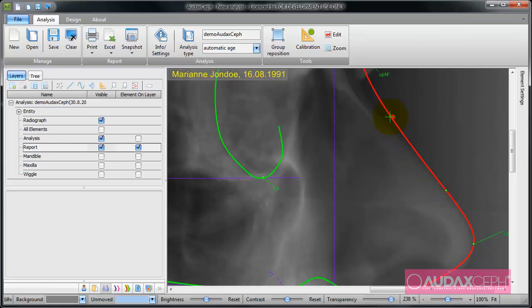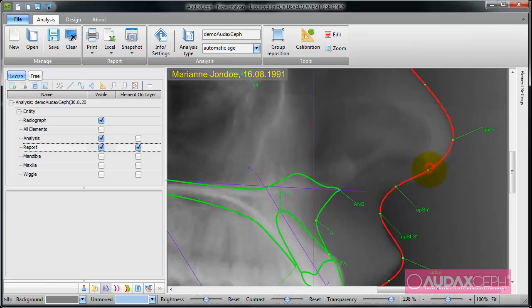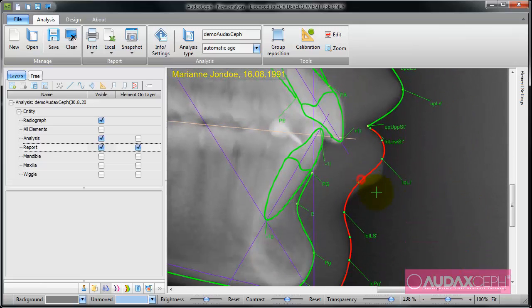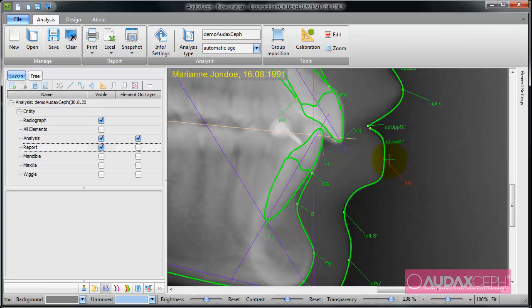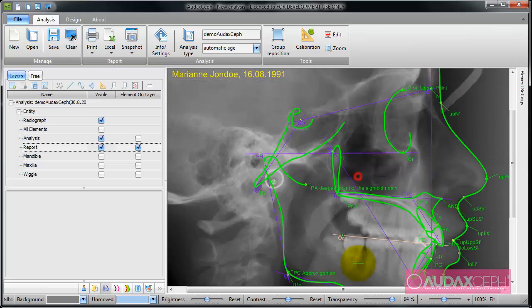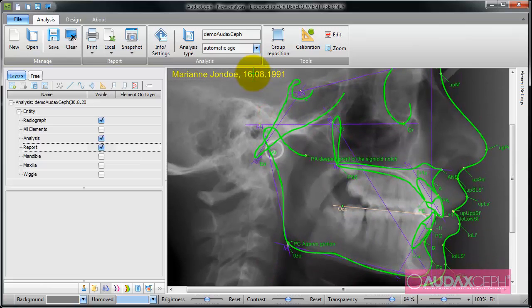I can add points here, and I can move this point here and this point here to adjust the silhouette.